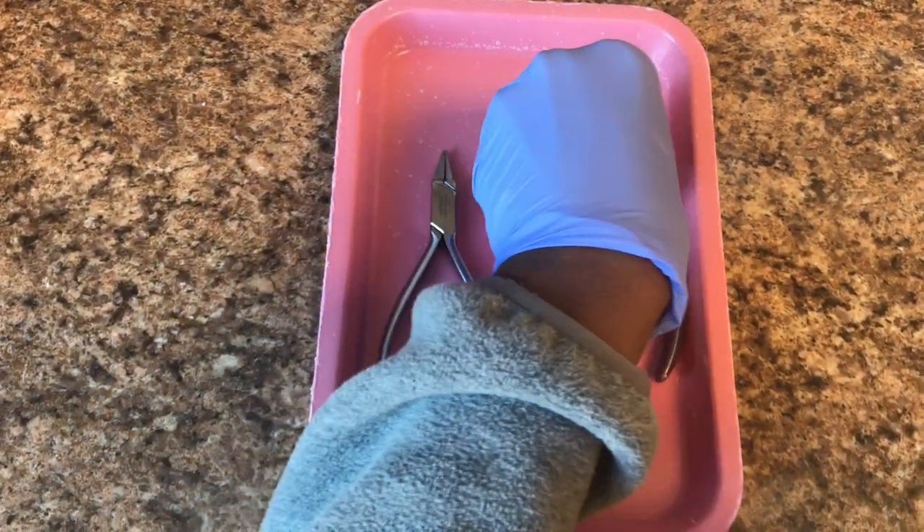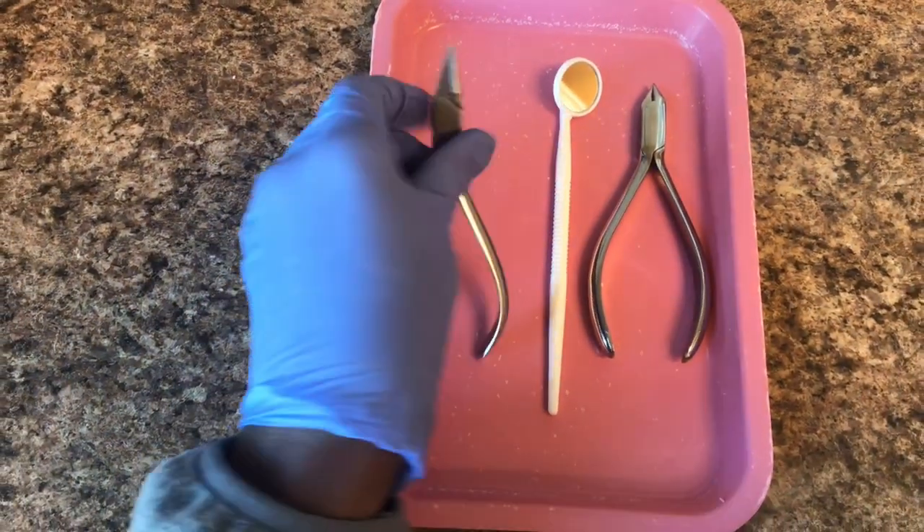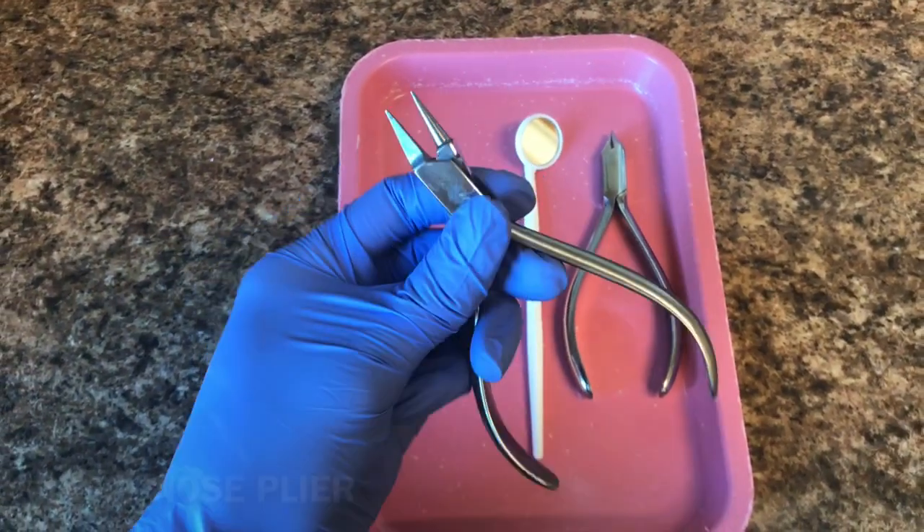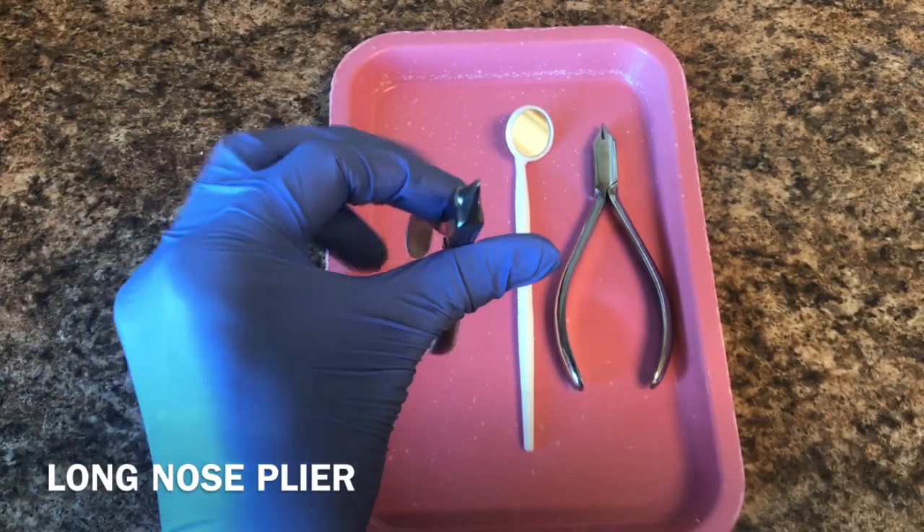This plier is used basically to adjust Hawley retainers, which are your metal retainers. The doctor may have a preference for this plier here — it's called a long nose plier, and it only has two little noses and it's long.